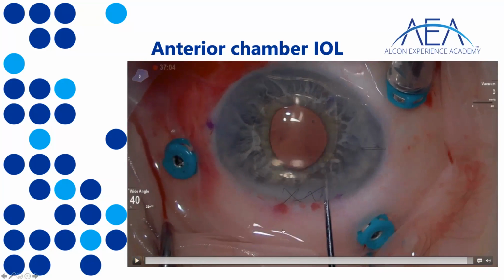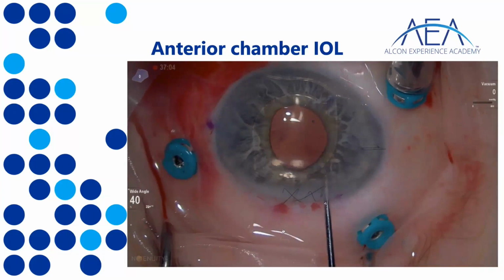I'm going to stop here just a second because I want to briefly introduce a different kind of technique for the anterior chamber. I hope that you will be able to see my laser pointer coming up, which is called sort of the frown technique.